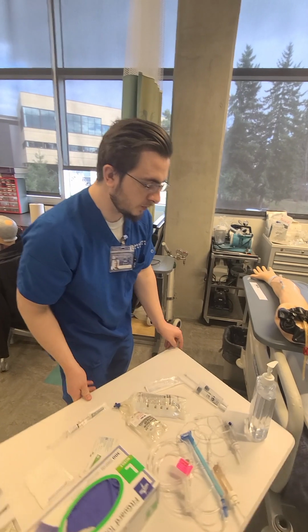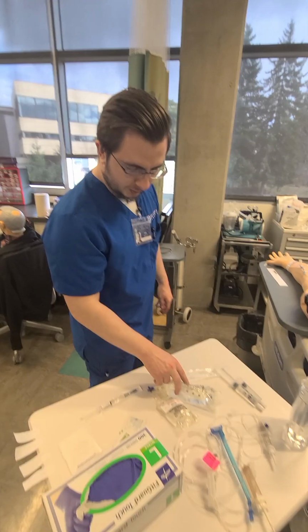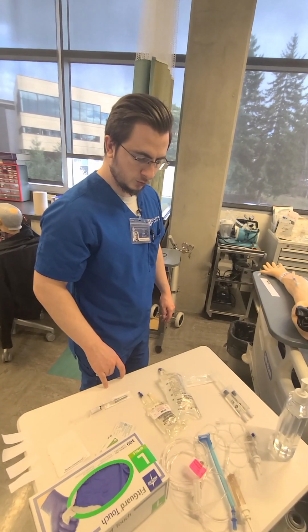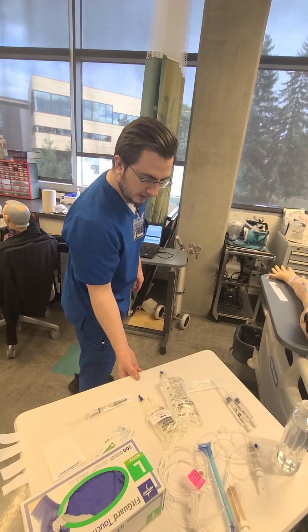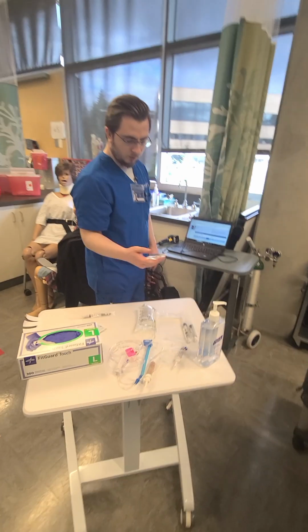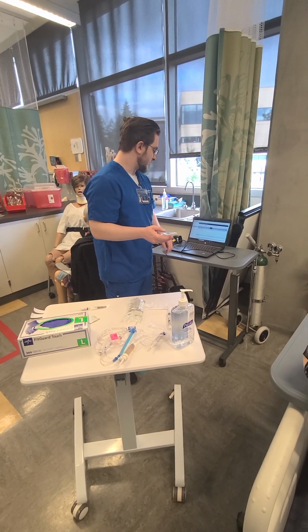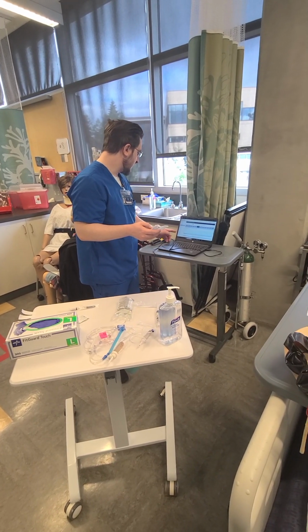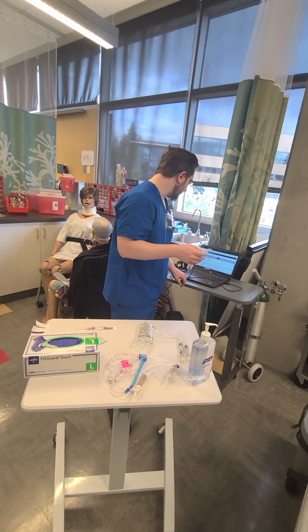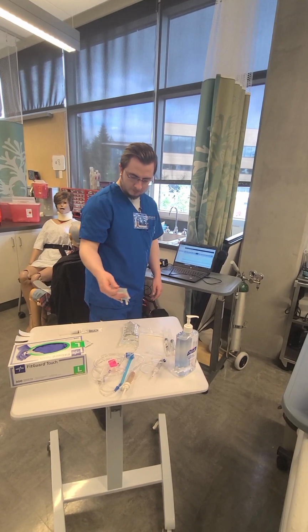Don't have to worry about them for any of the medications we're giving you. I have 2 meds for you. I've got ciprofloxacin, which is an antibiotic that your doctor ordered for your infection, and I also have some Zofran for your nausea. I'm going to scan everything in. I'm going to do my 5 rights again real quick before I scan everything in. So Cipro is the right patient, Erica, right medication, Ciprofloxacin, the right dose, 400 milligrams, the right route, IV, and the right time, noon. It is due now. That is good.